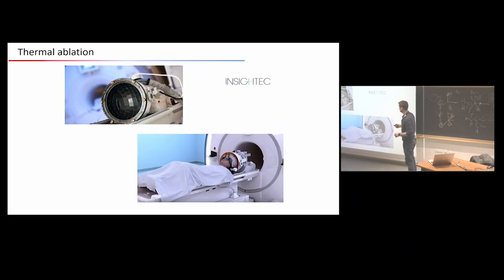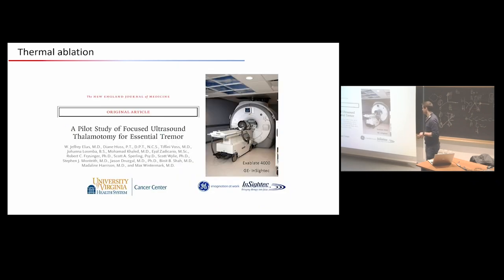So this is the one from Insightec. So you see there is a stereotaxic frame, and the patient is going with this under the MR. This is MR compatible. So those therapies are applied now in clinics, and I'm going to show you one of the most famous applications, which is for the treatment of essential tremor.